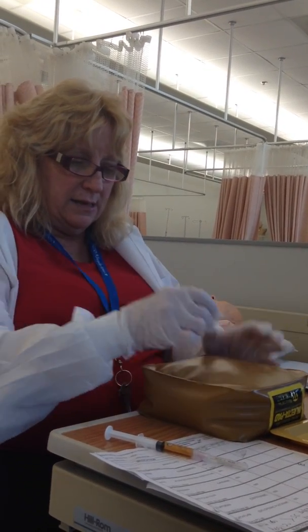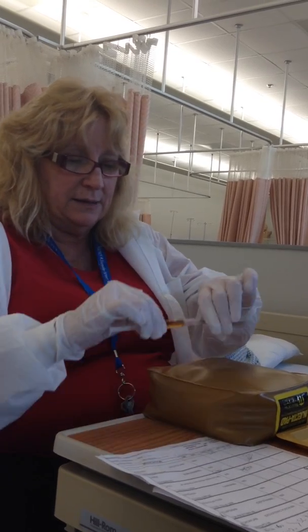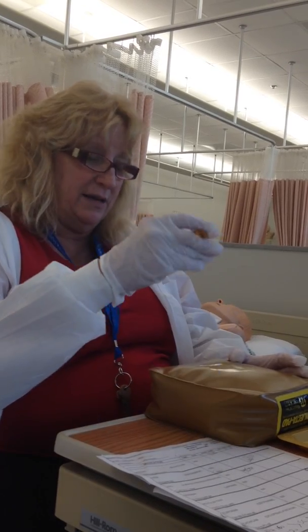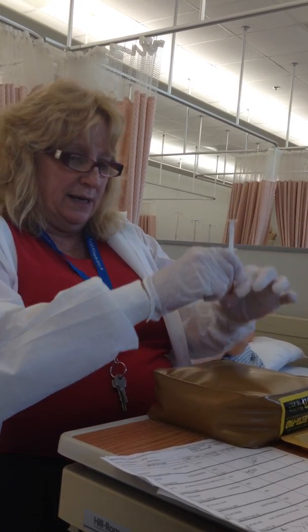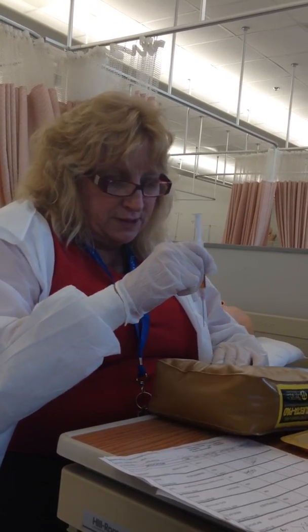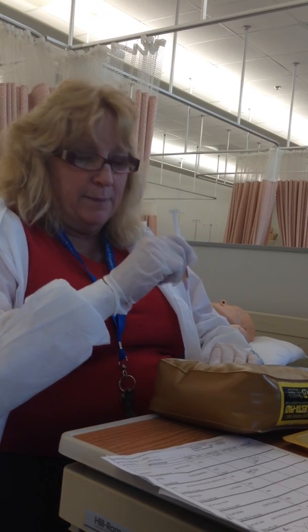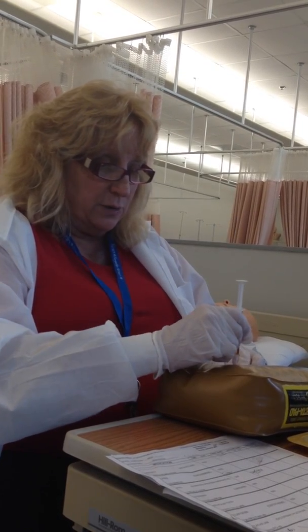Okay, and I'm going to find the ventral gluteal site, which I'm going to show you again, and take this cap off. I had a student once in testing who set that down like that. That's a fail. Okay, so here we go with the medication. We're going to inject at 90 degrees, and we're going to pull the skin. You're pulling the subcutaneous and the dermal layer over, and the muscle stays where it is. So we're going to inject straight down 90 degrees.